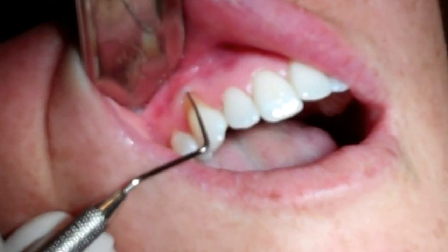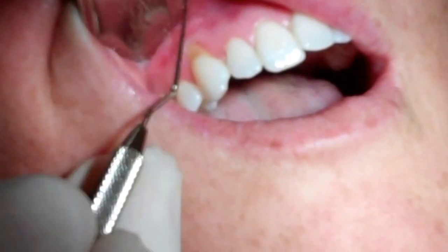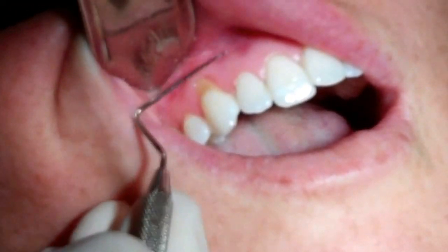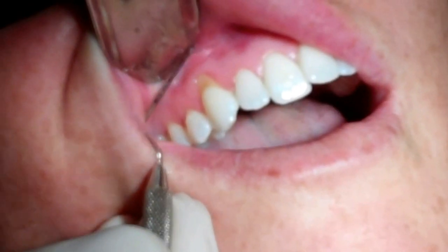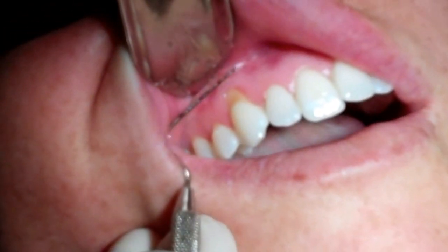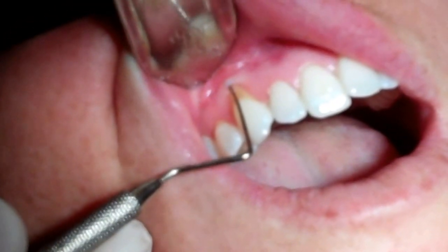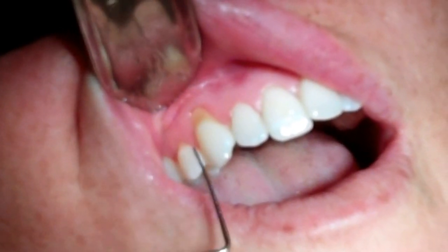So what we would do is we'd measure this pocket, and her pocket depth is about 2 millimeters. You can almost see the ruler go underneath her tissue. But what you look for is you measure the pocket depth, and then you put the probe horizontally and push up in a vertical fashion. And when you see the tissue fold over, it's called the mucogingival junction. You can measure from that pocket depth to the mucogingival junction, and there's really no attached gingiva.